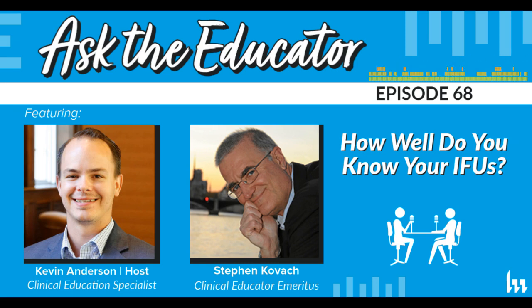And I just happened to be in a surgical case. It was a laparoscopic gallbladder removal. And one of those cords that you're talking about, a reusable monopolar cord, literally sparked and severed right in the middle of the surgery. And I would believe that this is part of the reason why it calls for this kind of testing in the IFU.